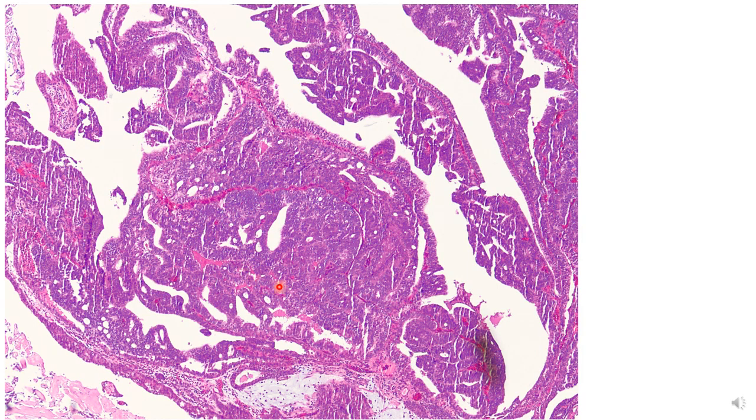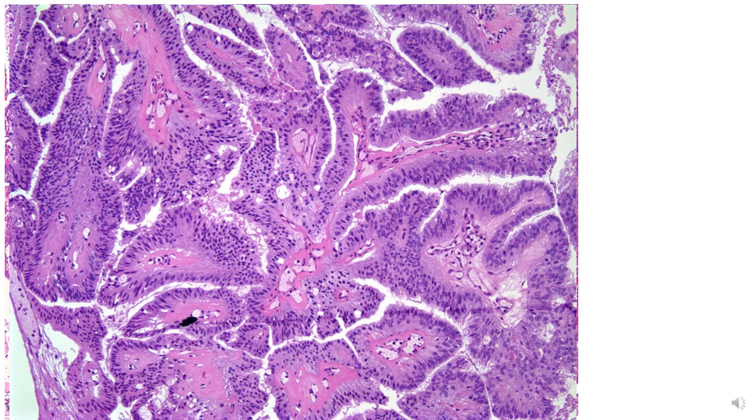So our case one, if you look at it, has a nice mixture of papillary and somewhat cribriforming morphology. This presented as a urethral polyp where prominent papillary morphology is the common manifestation, like seen in this particular example. But the feature that should raise your suspicion regarding ductal adenocarcinoma is that the lining of these papillae is somewhat columnar with prominent pseudostratification. Nuclei are also relatively quite monotonous, but sometimes urothelial carcinoma can also show somewhat similar morphological presentation. So that's a very important differential diagnosis. Always consider these two entities in your differential diagnosis.